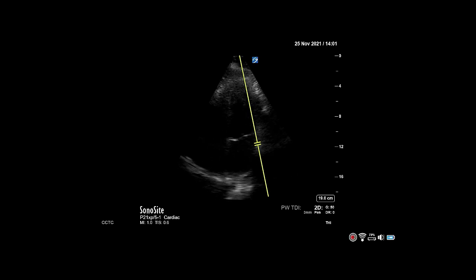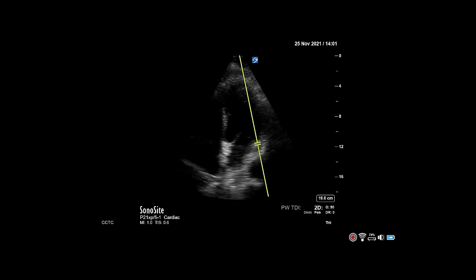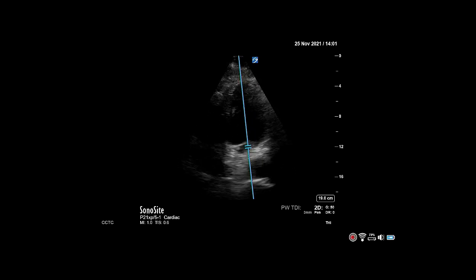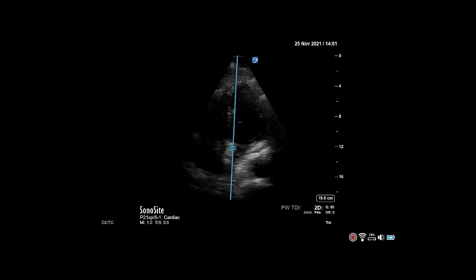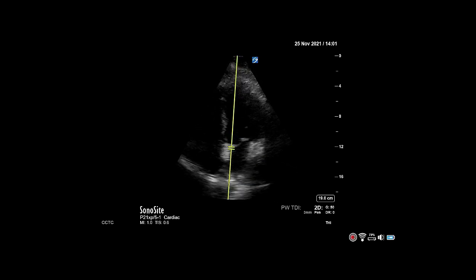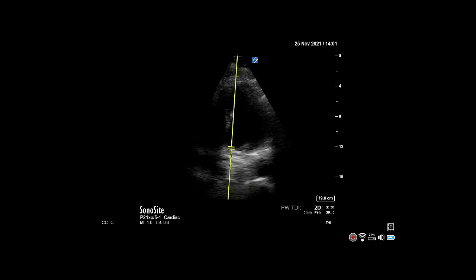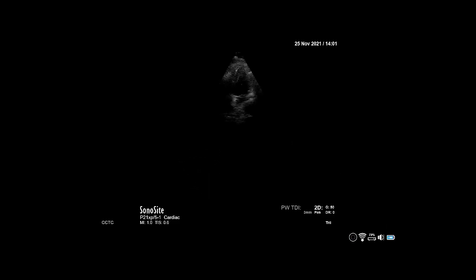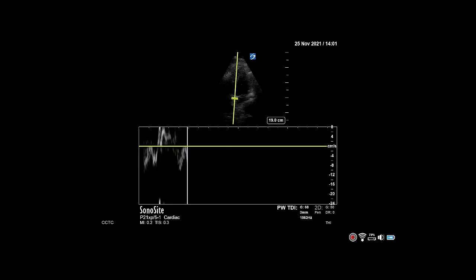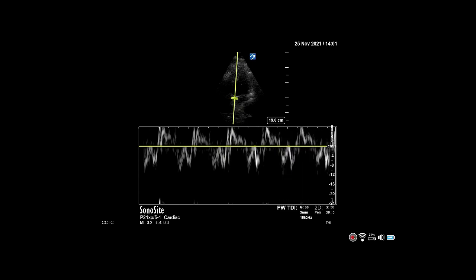Next, perform the same maneuver on the septal wall. Use tissue Doppler to measure the movement at the annulus of the mitral valve. Normal is greater than 7 cm per second.